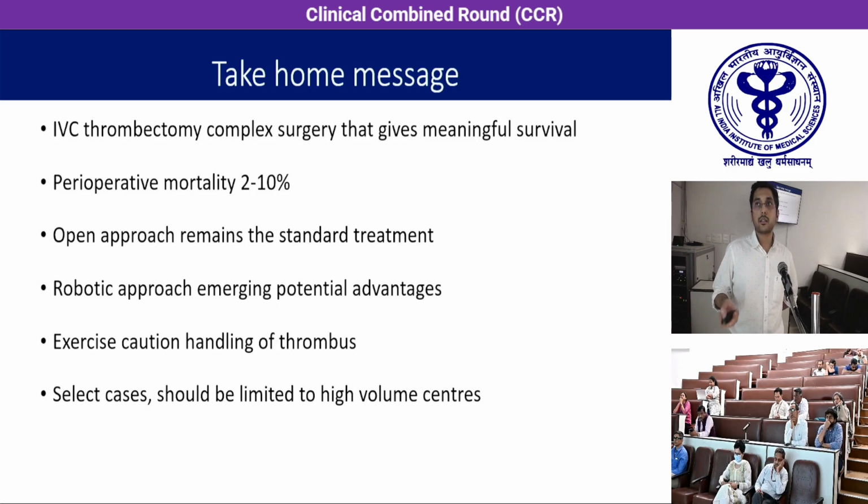However, the robotic approach is emerging, and the urologist should exercise extreme caution in handling the thrombus, because a pulmonary embolism is practically possible at every step of the surgery. So it should be done in selected cases and limited to high volume centers such as ours.